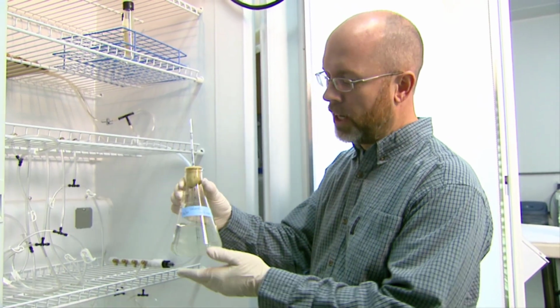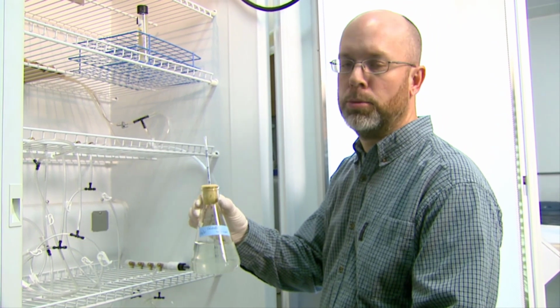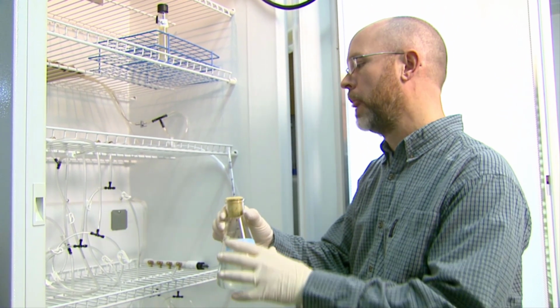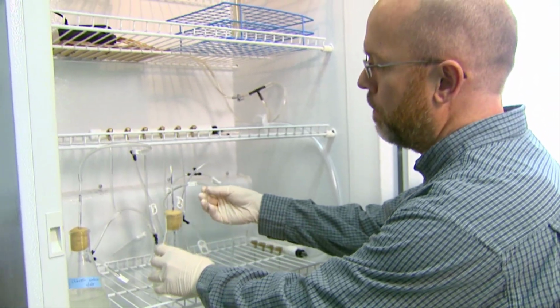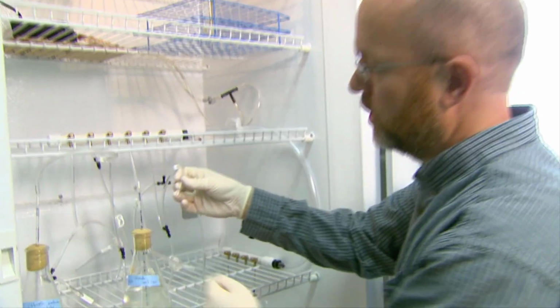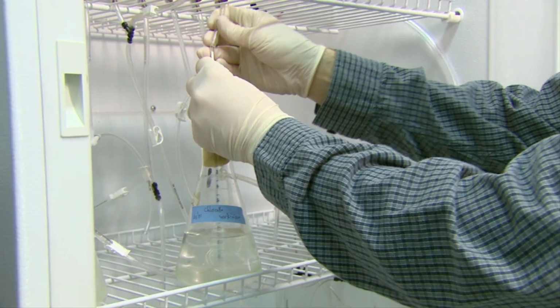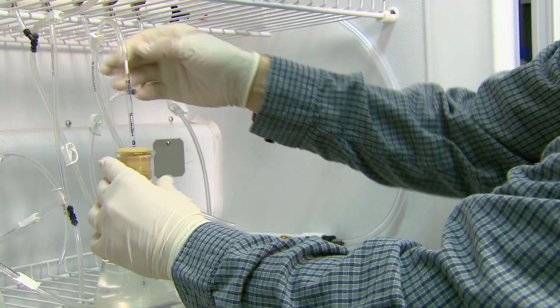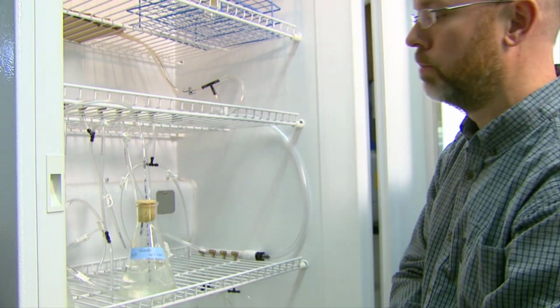So now that we have the inoculum in the flask, we have our media, our bubbling tube. We just need to put it on the aeration at this point. Remember, it has to have CO2 to grow. So we just have this little aeration apparatus. You can use whatever aeration apparatus that you want. In this case, this particular diameter of tubing fits right on the end of these 1 milliliter pipettes. And then these little clamps, you just open the clamp and it starts bubbling.